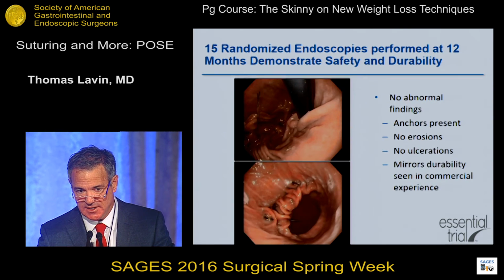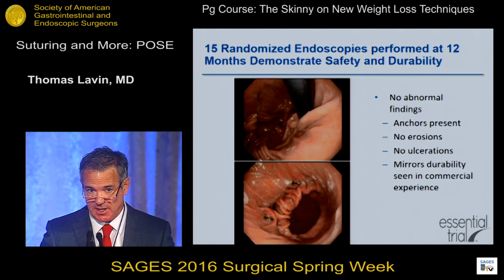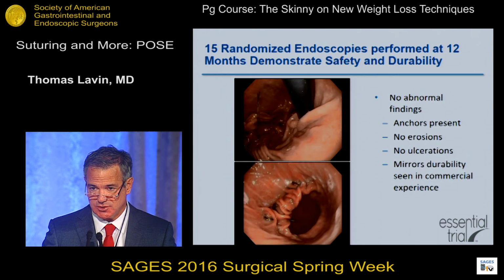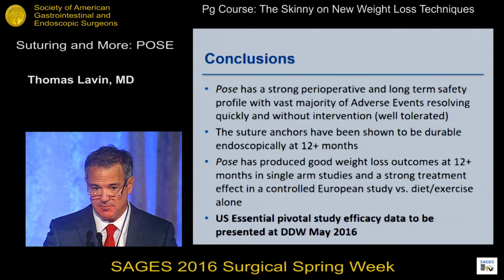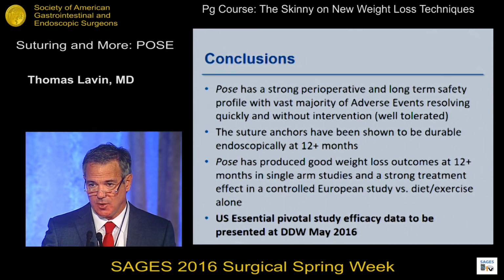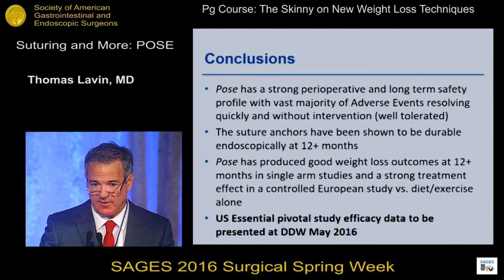We did 15 randomized endoscopies at 12 months, and you can see these full-thickness bites are totally intact at 12 months without erosions or other ulcerations or problems. That was consistent with all the endoscopies and the post-procedures that have been done over the years. These are long-term durable anchors. So in conclusion, POSE has a very strong safety profile, and these appear to be durable anchors long term, and the weight loss outcomes are good.